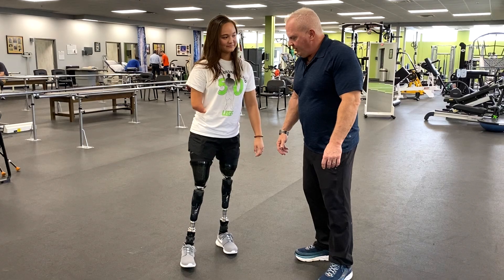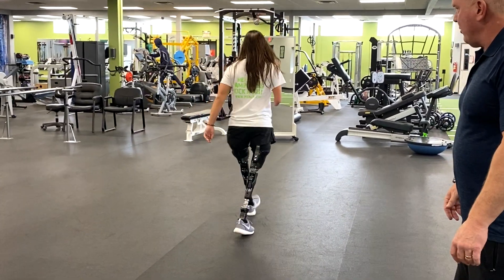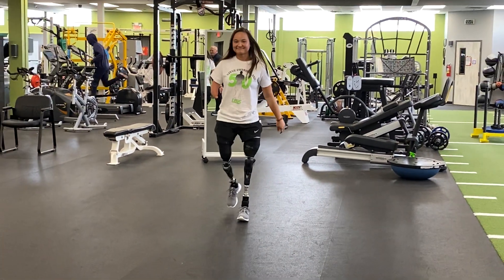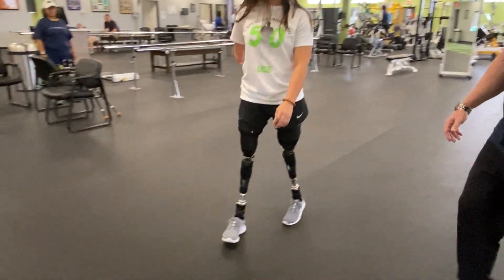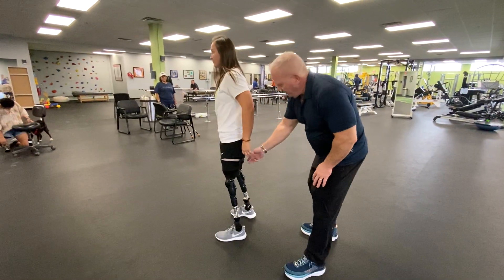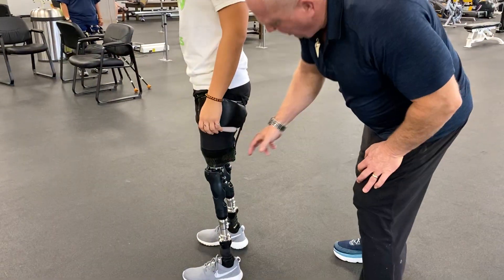Can you walk for us first? And you can see how the strut straightened up. Let's show what happens from the side here — if you can just turn. So here is the socket, and then we have the strut and the lower socket.